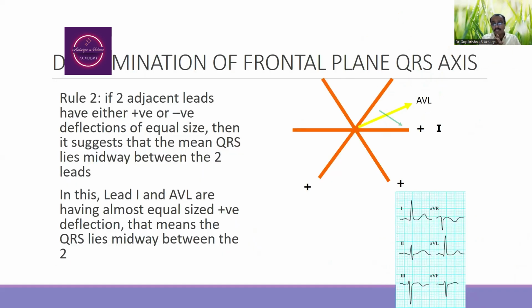When you think about the second rule, we have to identify the two adjacent leads in the given ECG strip that are exactly identical.